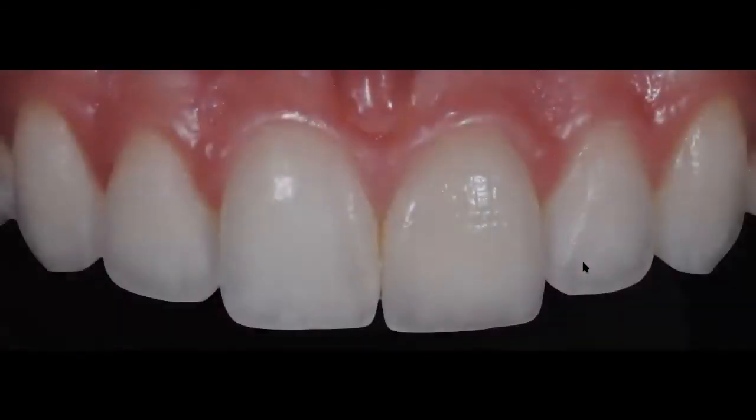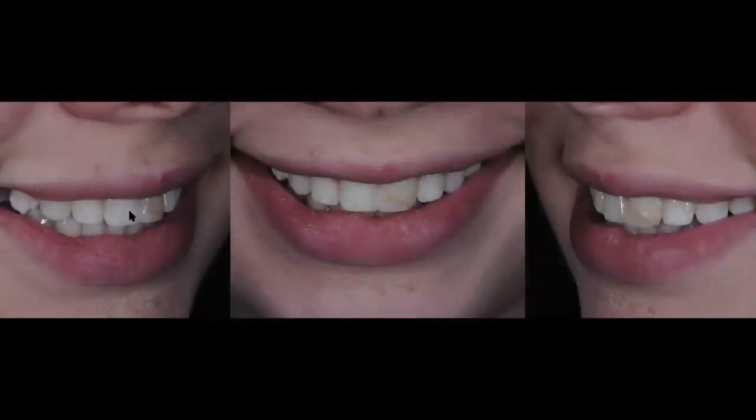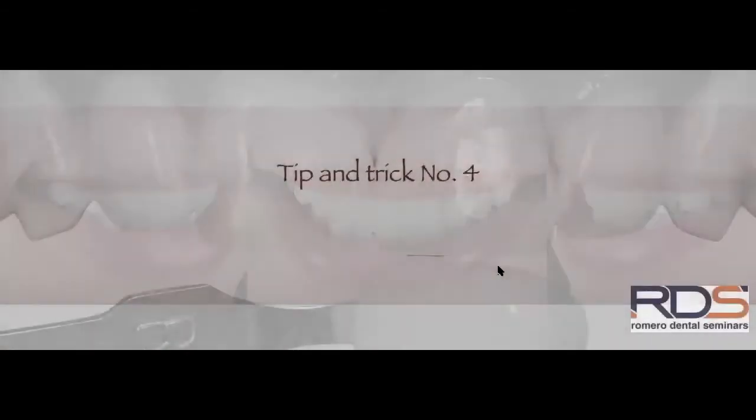The patient was very, very happy. Look at the high luster. This is the natural tooth. This is the porcelain veneer. Look at the high shine, high gloss, texture, everything. Look at the line angles, everything matched, and it's because the lab was looking at every single detail. You can look at the incisal third, and you can see the before. This is how we started. And now you can see the final restoration delivered, and the patient very happy with it.